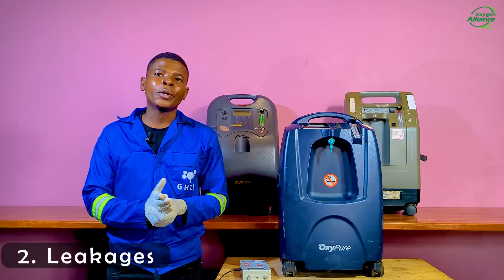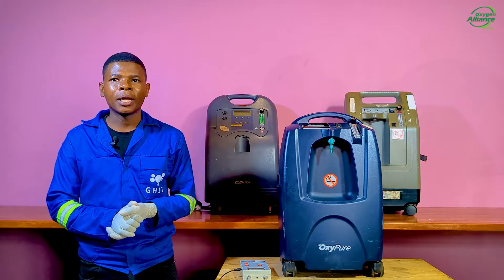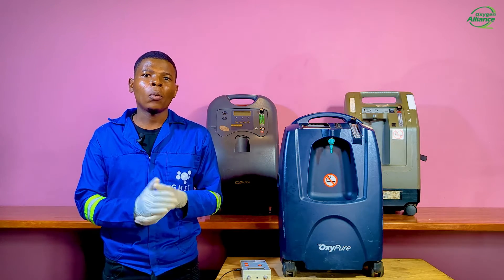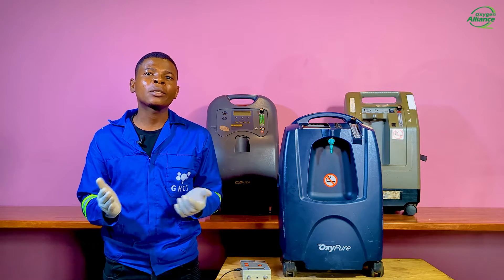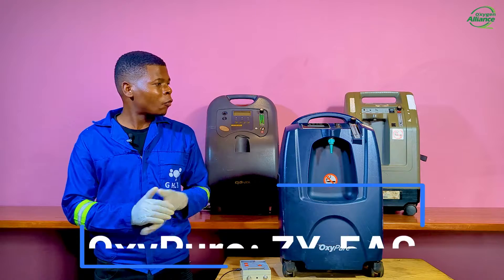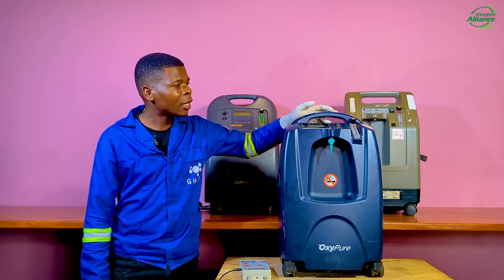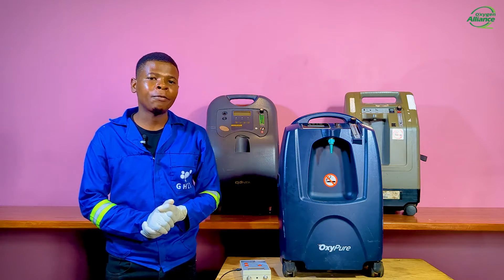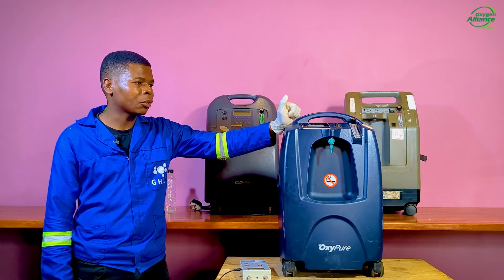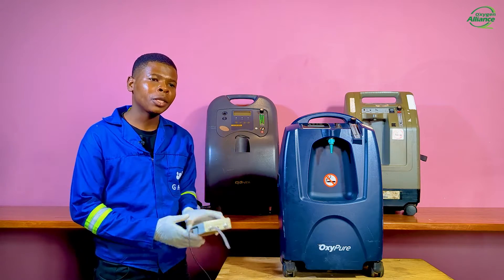The second common cause of low oxygen purity we are going to discuss today is leakages in the pipes inside the oxygen concentrator. Leakages cause the pressure not to adequately build up for the absorption process to work. One indication of leakage is low pressure from the patient outlet. For this model, the oxygen concentrator ZY5AC, the normal outlet pressure is 58 kPa, so getting a lower value may actually indicate that there are leakages inside.